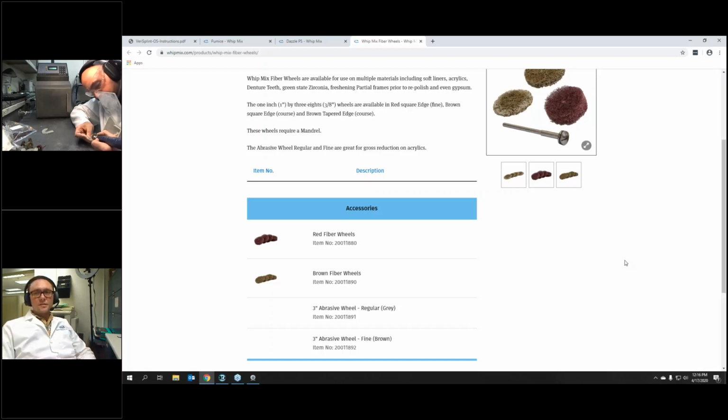with printing splints. So part of that is, instead of using that crosscut burr that we mentioned earlier, he's using these abrasive wheels, which don't dig in as much, especially if you're going with light pressure. You're not really cutting at it as much as sanding away evenly across that surface. So after you've done some practicing, you keep even light pressure, then you're really just adjusting it all at a surface level. And then of course, each step down from there is less aggressive. So as long as you're not being too aggressive with your grinding, then you shouldn't really affect those contacts.